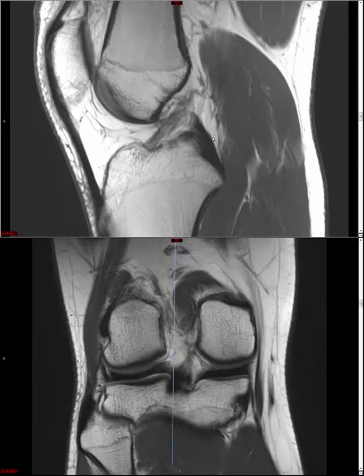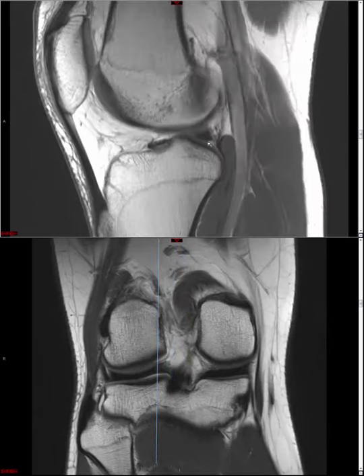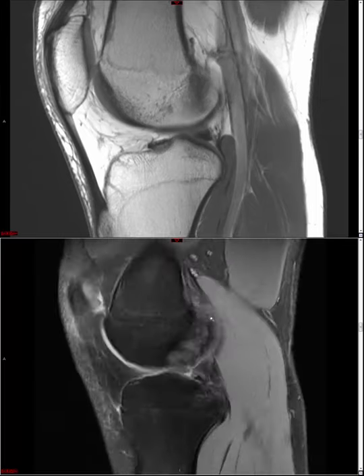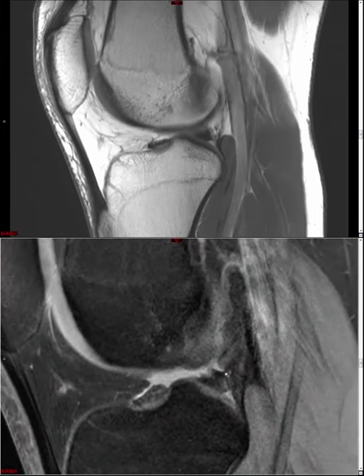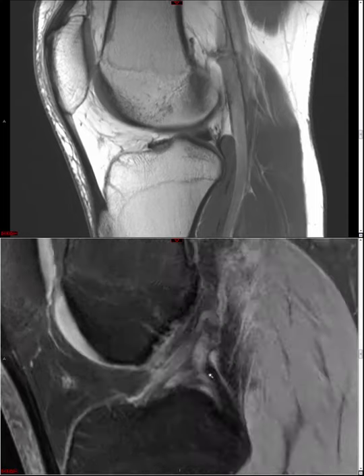But if we were to, say, pick an image like that, perhaps, and we interpret this here as being part of the meniscus, we might erroneously diagnose this irregularity here as representing a meniscal tear. Let's just see if it shows up nicer on the PDFS a little bit more. So if we interpret this whole thing as being meniscus, we might call a tear conceivably over in here.